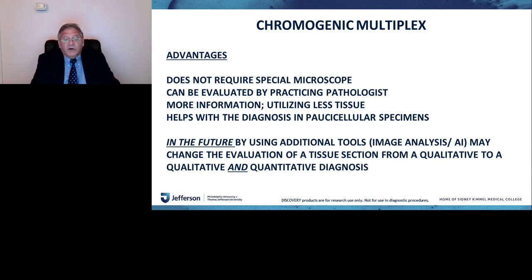So in other words, right now what we see as pathologists, we see a slide and we give a qualitative diagnosis. In the near future, I think we're going to be able to quantitate our diagnosis and give a qualitative and quantitative diagnosis at the same time.